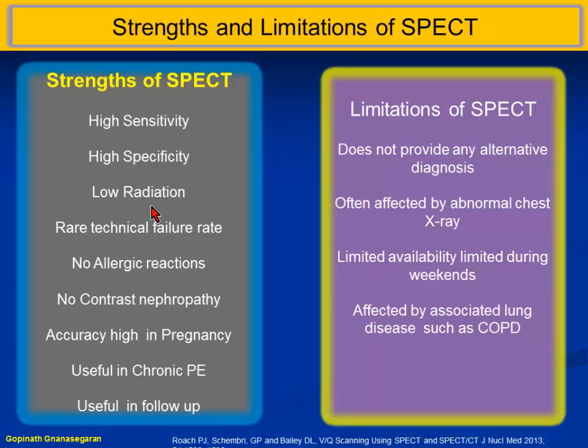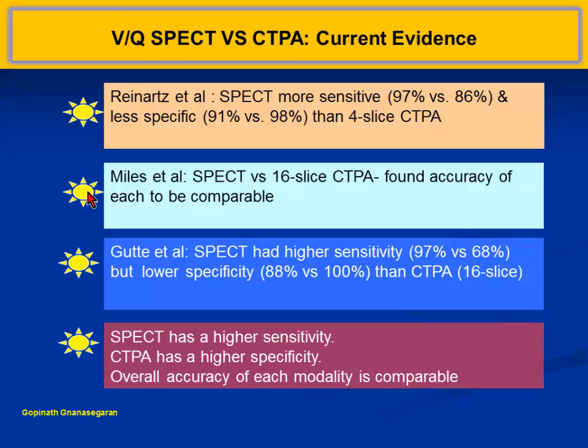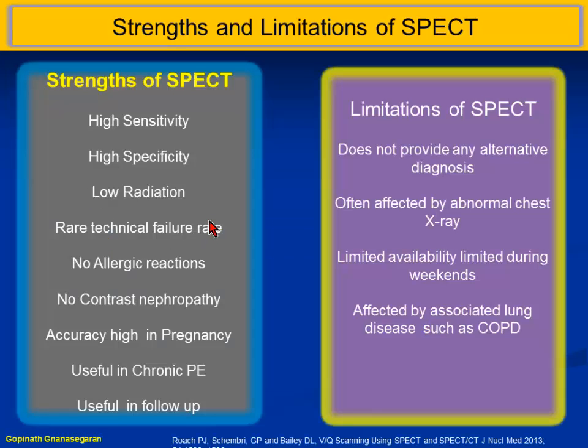Strengths of SPECT, as I said: high sensitivity, high specificity, low radiation dose, rare technical problems, no allergy, no contrast problems, useful in chronic PEs and useful in follow-up.